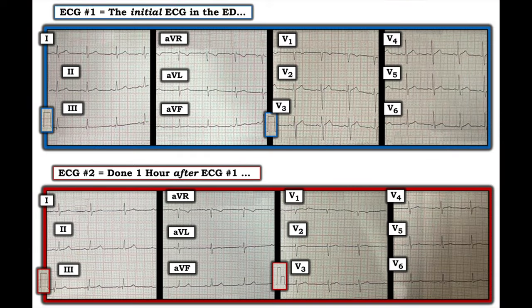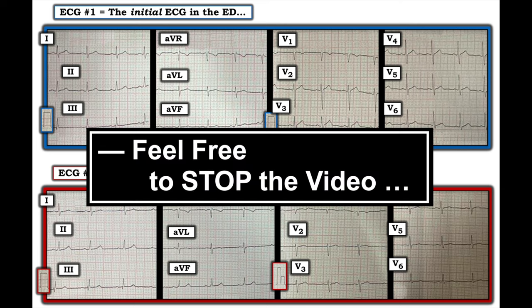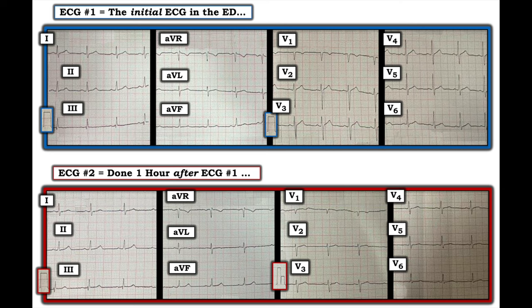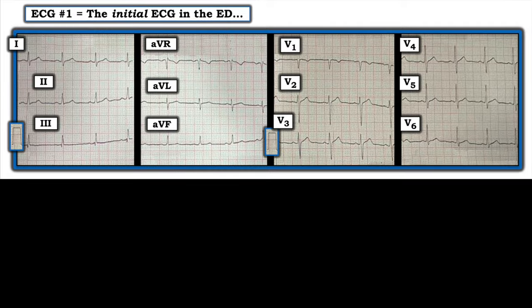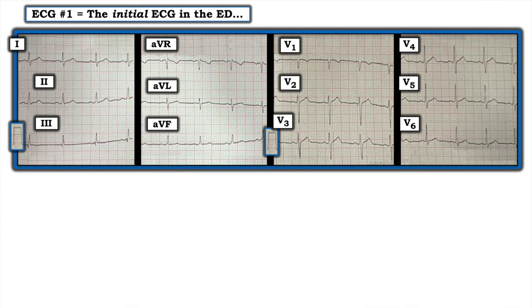I'd like you to just take a moment and look at this. We're going to go over in a second each of these tracings sequentially. Let's start out with ECG number one. This is the initial ECG in the emergency department. This patient presented with chest pain.